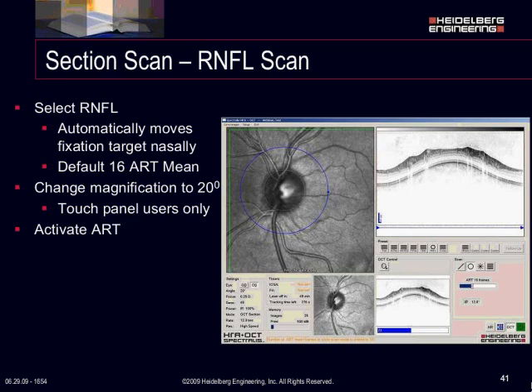So you can see the difference here. And now that the eye tracker is on with the live images down in the bottom, what you're going to want to do is move the circle over the optic nerve. In the large window, the one with the two green lines, it's now locked onto that image. The image is stabilized, it will not move, and you can position that circle exactly over the center of the optic nerve and get that blue circle equidistant around the optic nerve.